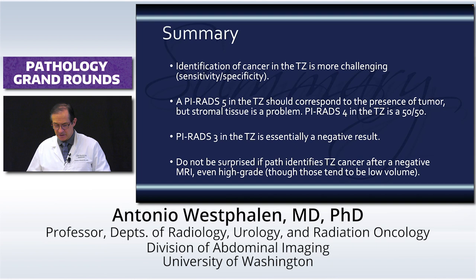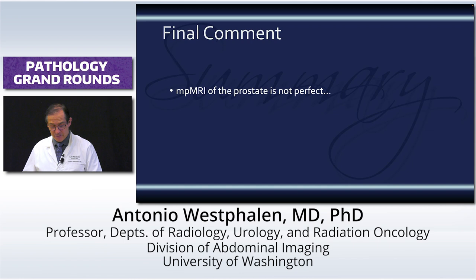So if someone is describing a PI-RADS 3 in the transition zone and it was targeted by urology, you should expect it to be negative, really, unless the radiologist miscalled it. And then don't be surprised if you do see tumor in the transition zone, and we didn't call anything because it just mimics benign tissue for us, and we have a very, very hard time. So the final comment, MR is not perfect, but it's definitely an improvement of what we had before.